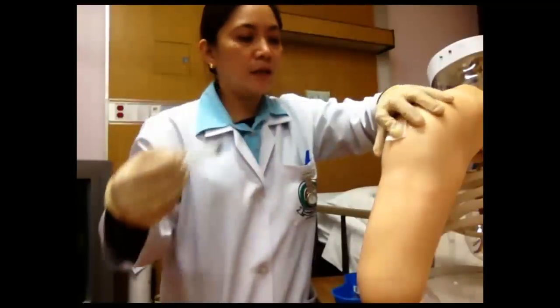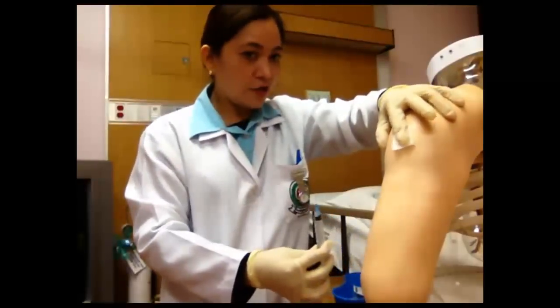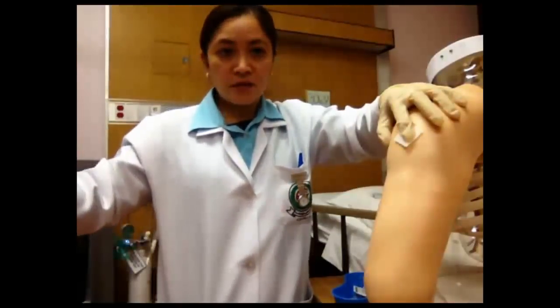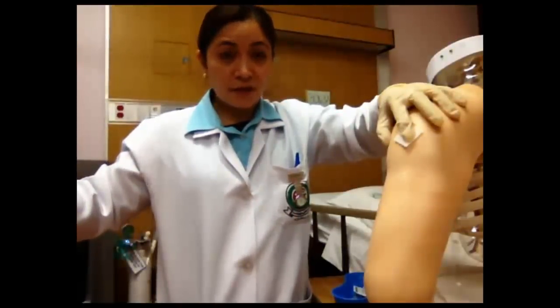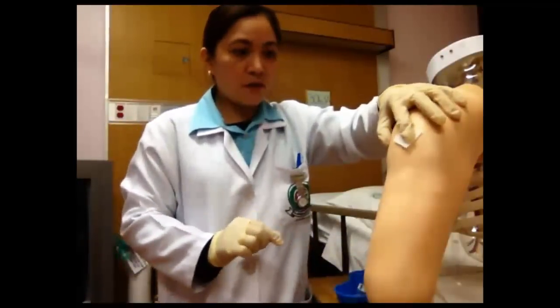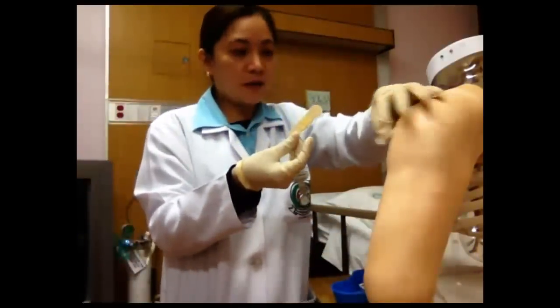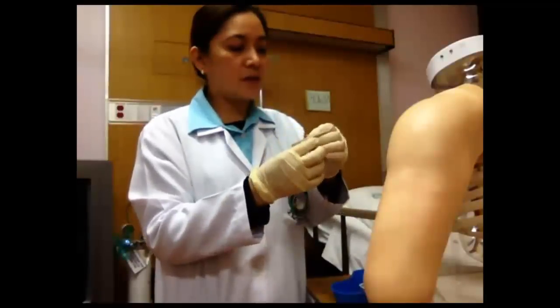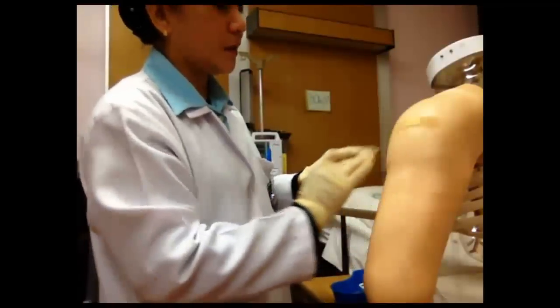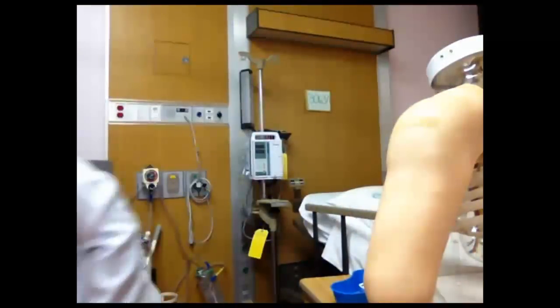Remove it quickly and massage the injection site. This sharp item should be directly placed into the sharp box if it is near you. But if it is not with you, you can place it in your kidney dish, and once you finish, place it in the sharp box. And then get your prepared band-aid to be placed on the patient's injection site. Okay, that's it. Then place it in the sharp box.